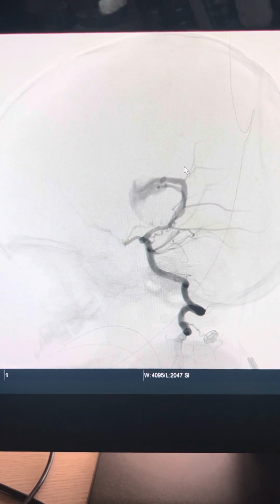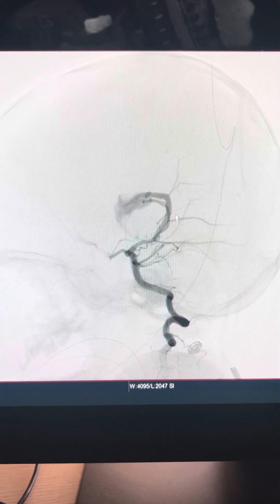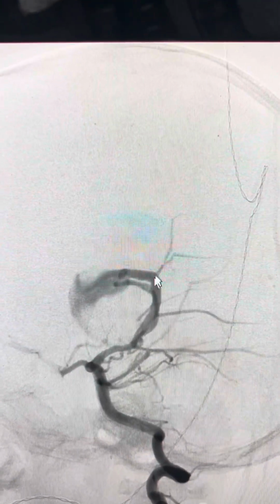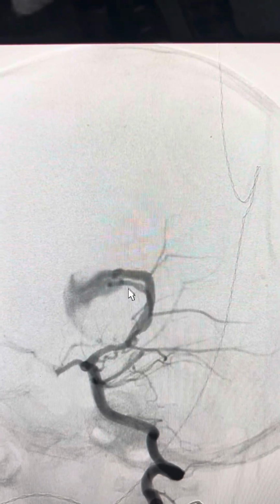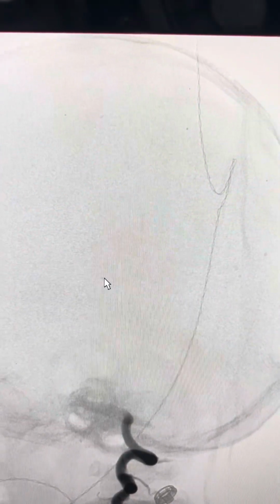In this particular patient, we did a roadmap run initially, and we do it on the run just to see where the big vessels are. You can see direct fistulous communication, 2 big vessels. This is the larger one, and that goes straight into this vein, markedly dilated again, and early drainage.